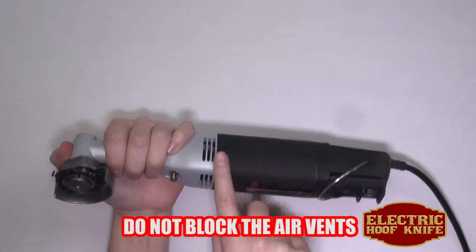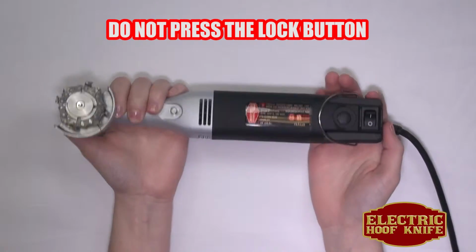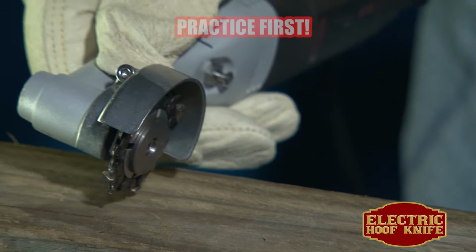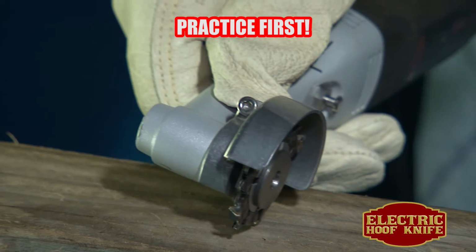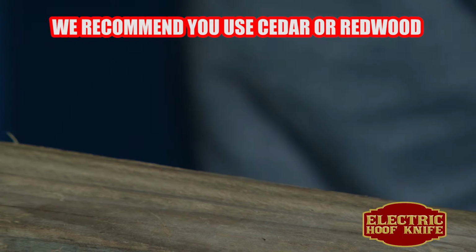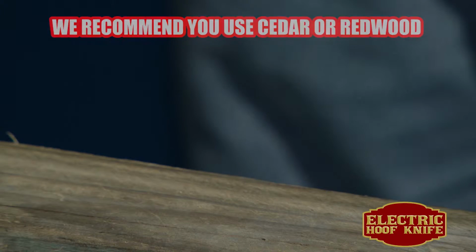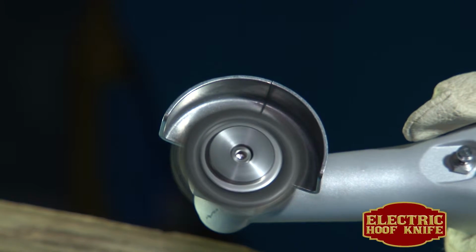Avoid blocking the air vents and try not to press the locking button while trimming, as this can cause the disc to chatter. When you first get your electric hoof knife, it's best to practice on a piece of wood before using it on a live hoof. We recommend you use a 4x4 block of cedar or redwood, as their densities most closely resemble that of a hoof. To practice, first position yourself to the block of wood like it's a hoof.